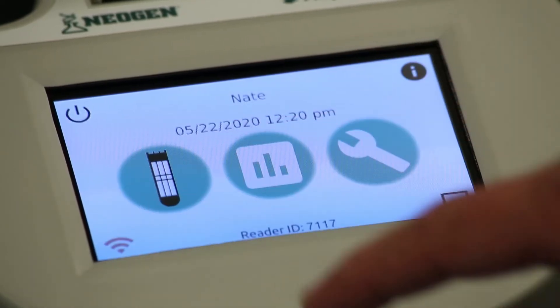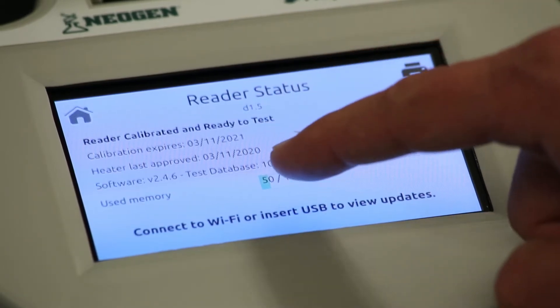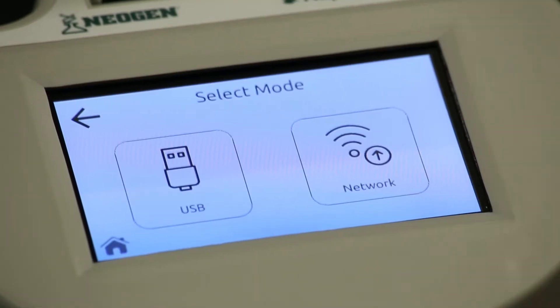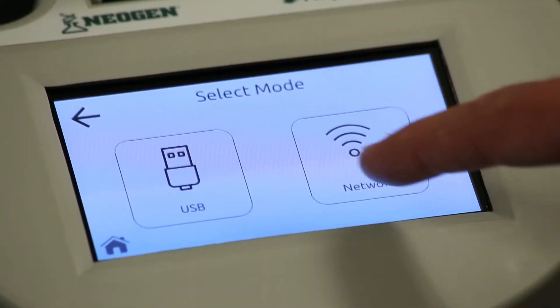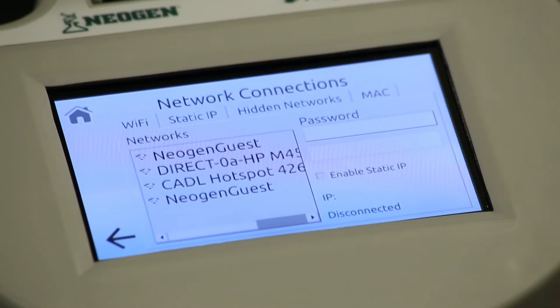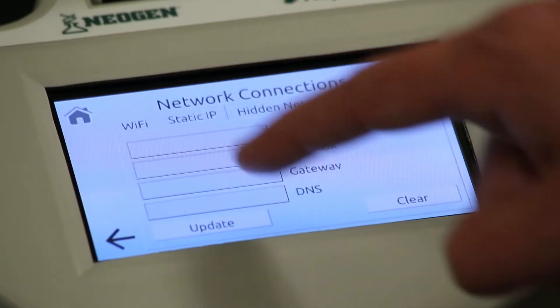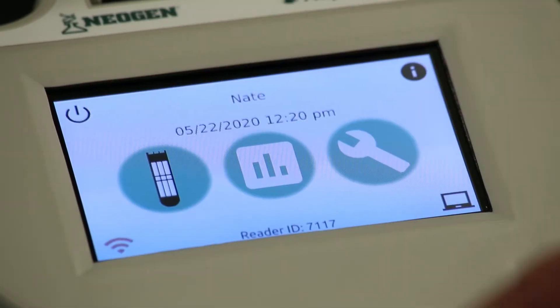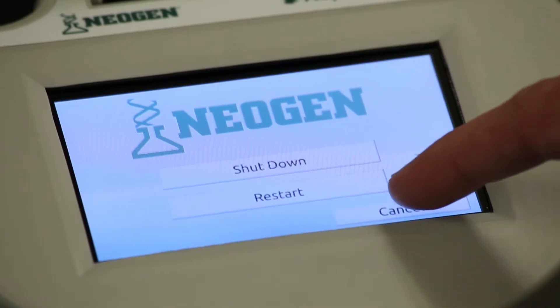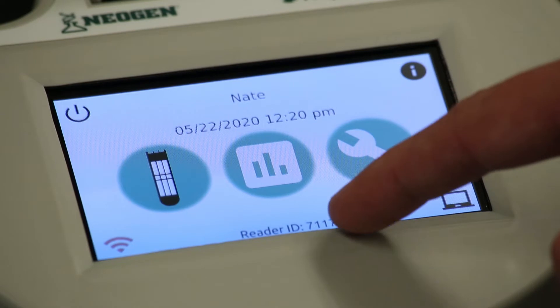Other home screen icons include information for calibration status and firmware upgrades, data transfer mode for USB data transfer only, a Wi-Fi icon to configure Wi-Fi and other connections, and the power icon to put the reader in power down mode. To turn the reader off completely, you must use the power button.